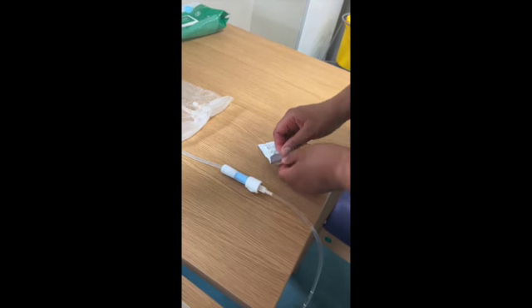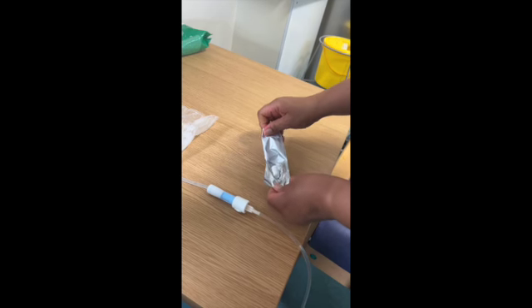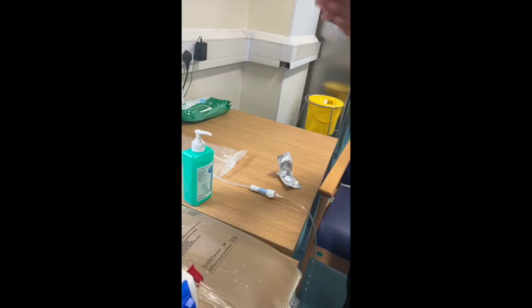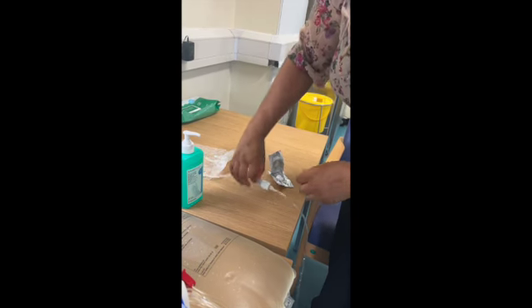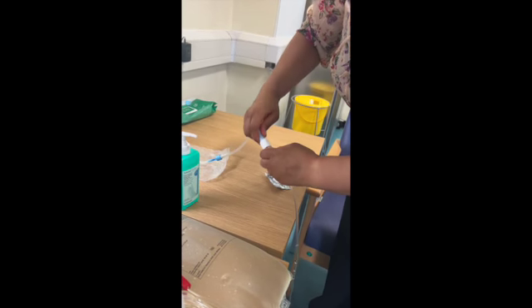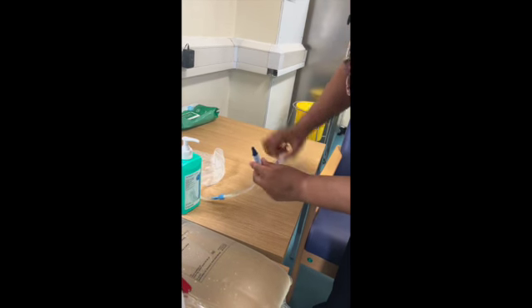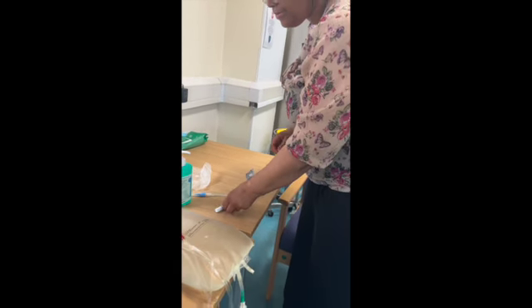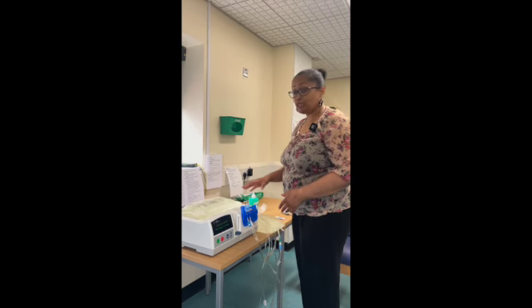So I'm looking for the arrow on a flat surface. I'm opening it up like so. Gelling my hands again. And then unscrewing. And putting the cap on. Now that the cap is on the catheter, I know that I'm safe and I'm able to strip the machine.